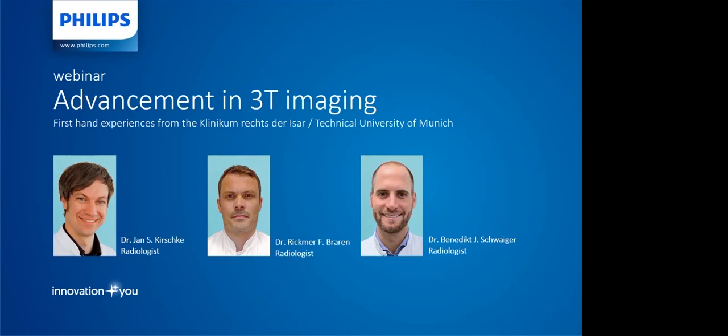We really cut down our 2D FLAIR images because it's like 3 minutes for a 2D FLAIR and 4 minutes for a 3D FLAIR. From our point of view, it's better to always make the same images, with better comparability between patients and so on. So we really cut down our usage of 2D FLAIR. But of course, almost all of our 2D images of the brain are currently also accelerated with Compressed Sense.